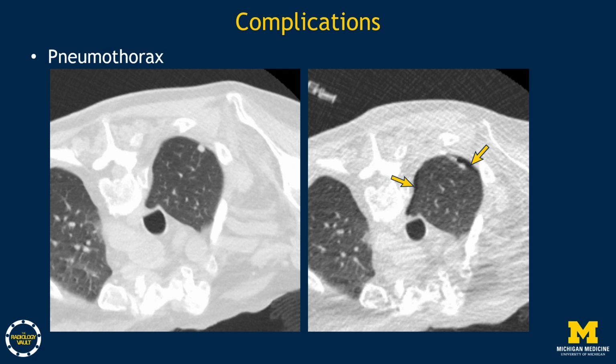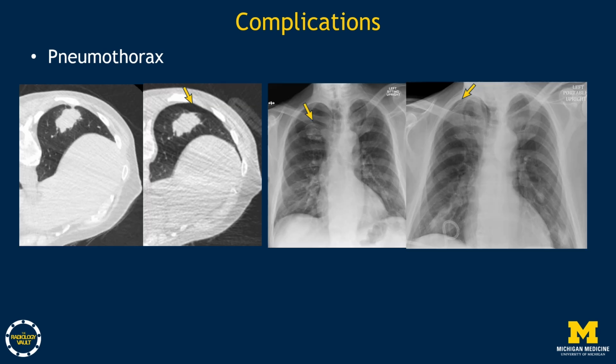In this patient with history of adenoid cystic carcinoma, a right lower lobe mass was biopsied but a small pneumothorax developed after removing the introducer needle. This expanded on the initial post-procedure chest X-ray, which necessitated placement of a pleural pigtail catheter. On the chest X-ray 24 hours later, the pneumothorax had decreased significantly, and the catheter was removed. Pathology confirmed metastatic disease, with adequate tissue obtained for genetic analysis, which subsequently tailored therapy and later resulted in a favorable treatment response.